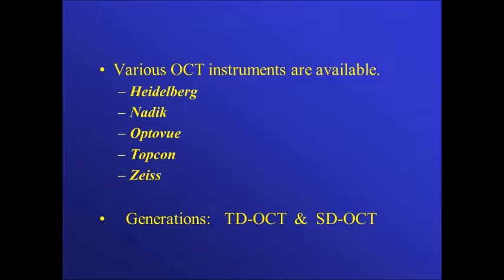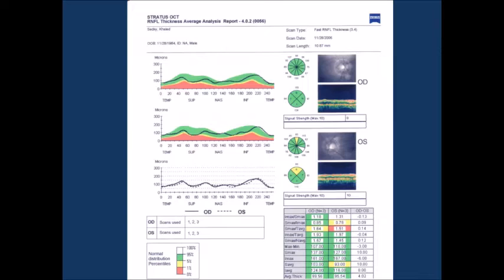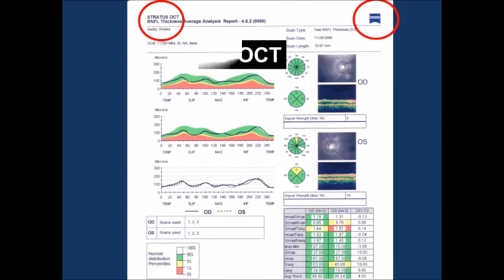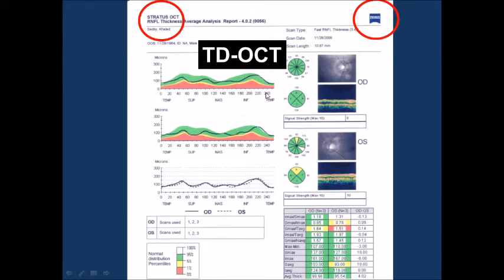We have different machines of OCT and also different generations of OCT. This is the Zeiss time domain Stratus OCT. As you can see, this is the ring examined around the disc. The nerve fiber layer thickness is detected and the numbers are displayed here in hours or sectors and compared with the normative data — this is for the right eye, this is for the left eye, and this is the comparison between right and left eye.